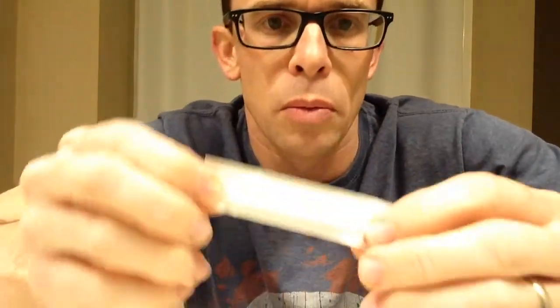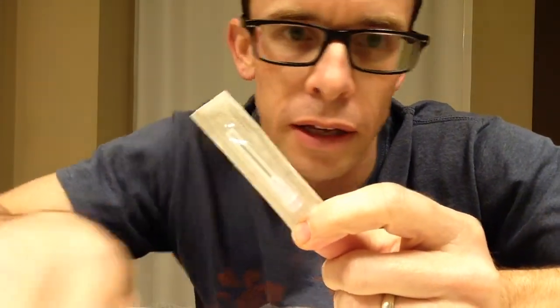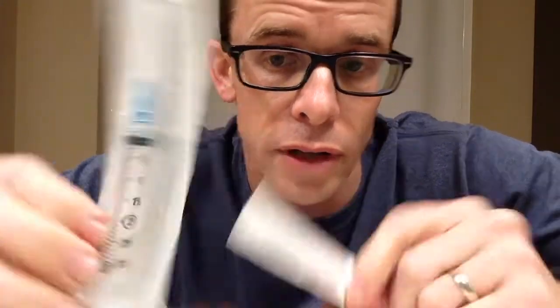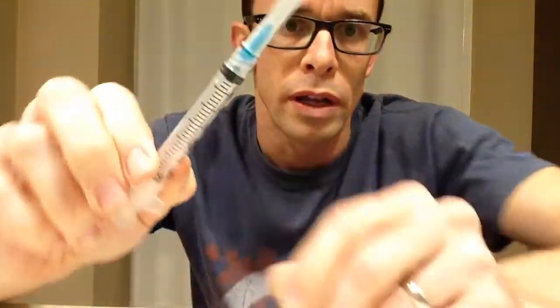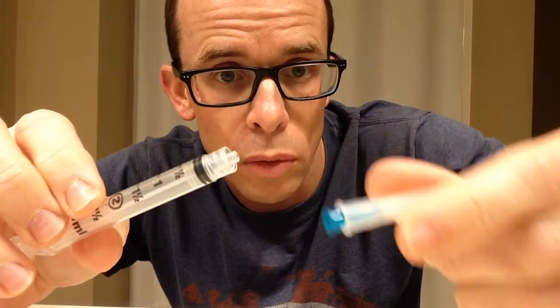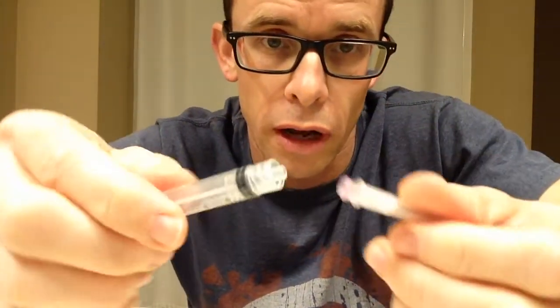My injections come with a drawing needle. This is a fatter gauge. And then it also just comes with the regular needle as well. This is the injecting needle on the top, but this is how it works. You open this up, and when I take this off, I can unscrew this. So as I unscrew this, this smaller gauged one will come off. Then I open this and I put the larger gauged one on, and it just screws right on.